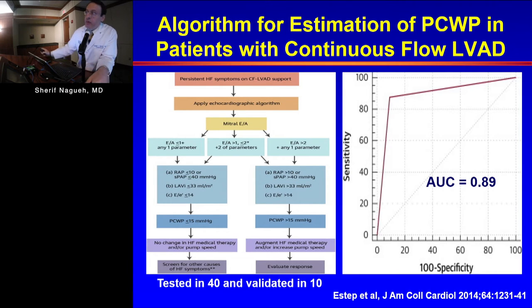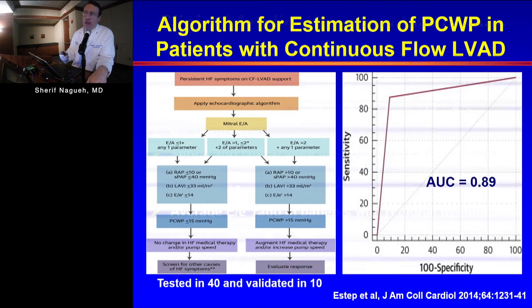Many a time people spend time trying to measure the velocities and look at the signals, but if the signal is of a poor quality, it doesn't help to measure a poor quality signal. You do not measure it and you do not use it to draw conclusions. Just because you have something before you doesn't mean you should measure it and put your faith in it. If you like the signal, if there are no technical issues with it, if it is clear, then you can measure it and work with it.